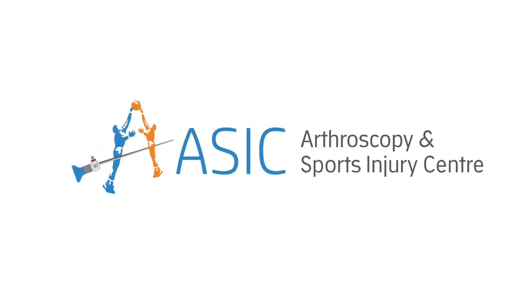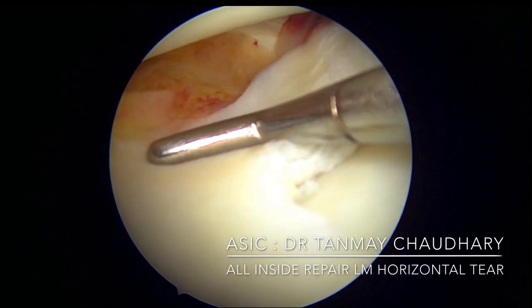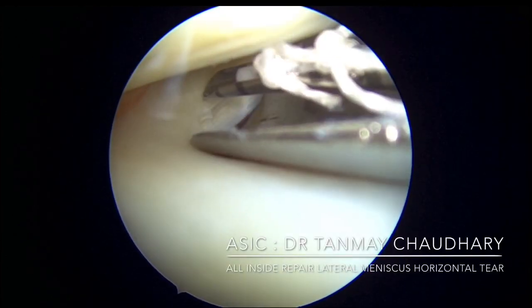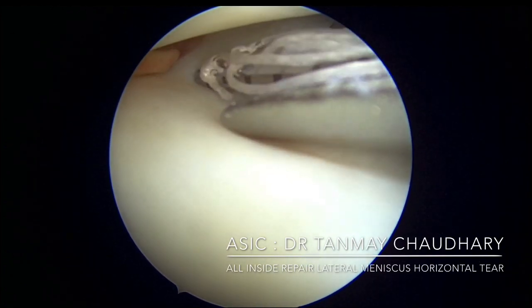Today presenting a case of a horizontal tear of the meniscus, showing an all-inside technique of repair. First, evaluate the tear and how many devices you would require, then put in the cannula.